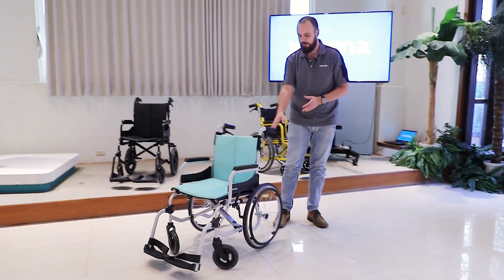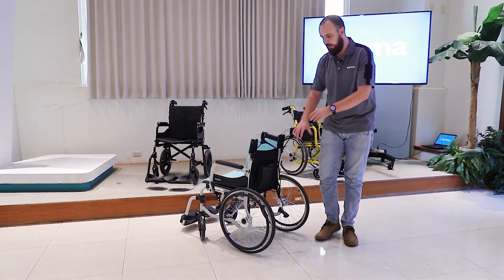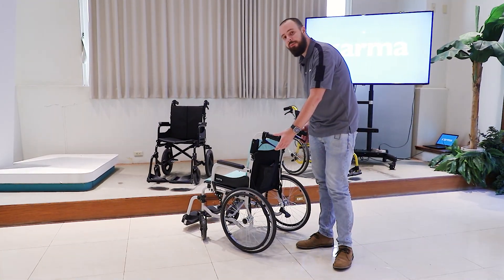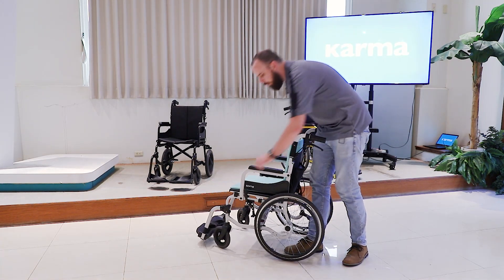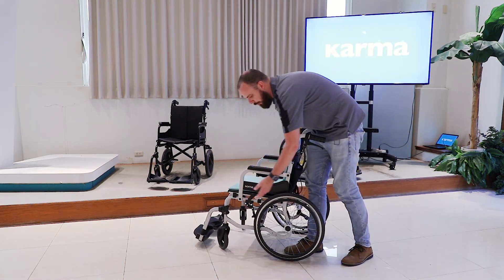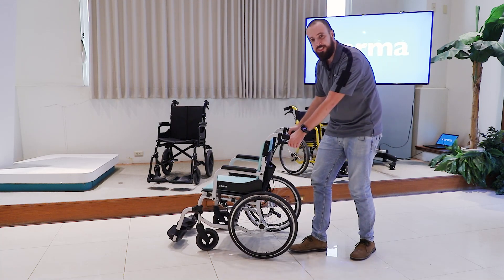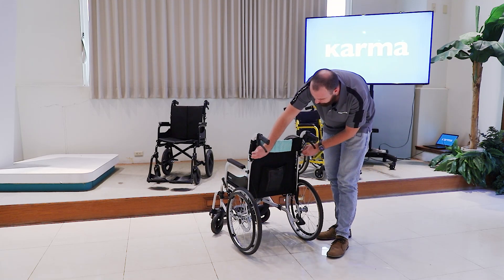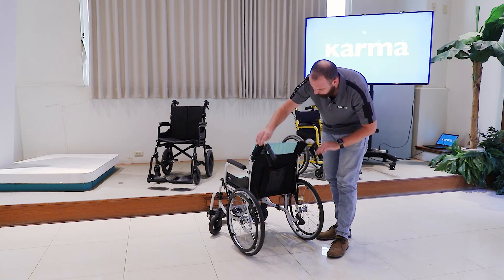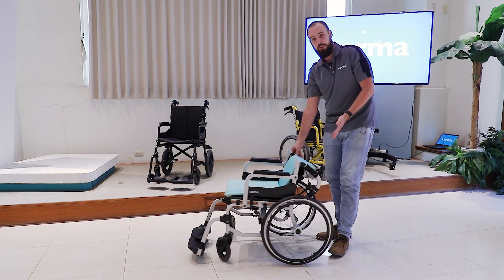Now I want to show you some standard features that are typically more premium but included on every Soma 215. We have dual attendant hand brakes attached to pull-to-lock brakes, so you can either lock the wheels or slow and stop the wheelchair using these hand brakes. We also have a standard fold-down backrest — just grab these tabs and move it down, so when you're storing the chair it gets even smaller.